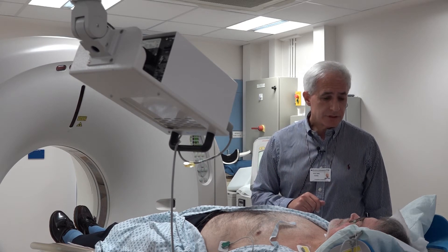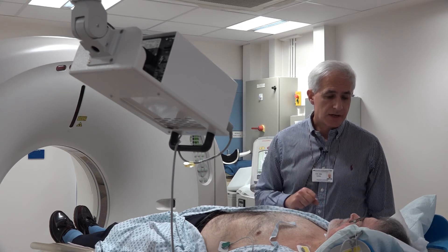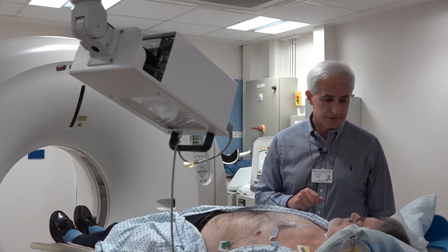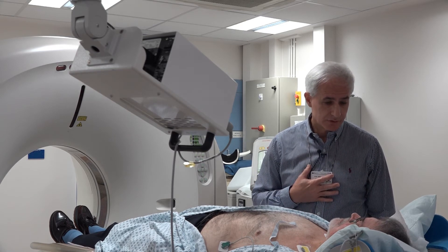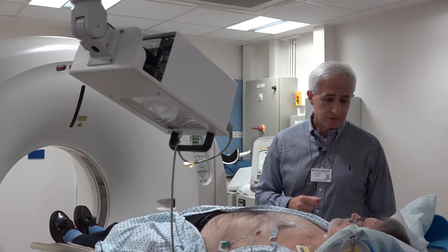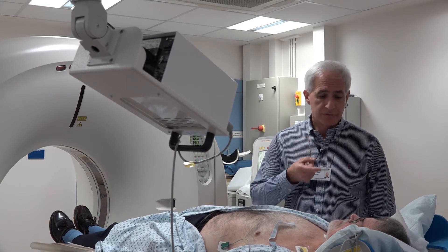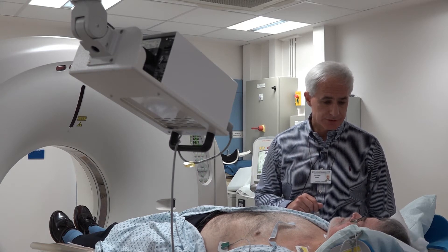GTN spray. We use GTN spray towards the end of the test to visualize your heart arteries better, because it widens up the heart arteries. It's a medication prescribed by primary care physicians for angina control — you may never have experienced angina, so you may not know what it is, but it's a very safe medication to give. Towards the end, we come in and ask you to open your mouth, raise your tongue, and we put one squirt of this GTN spray under your tongue.